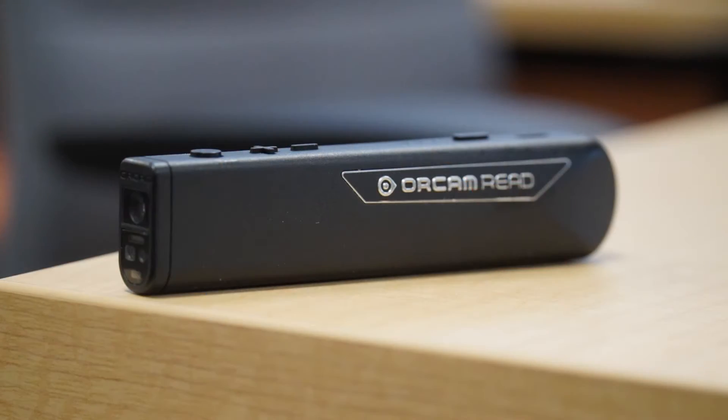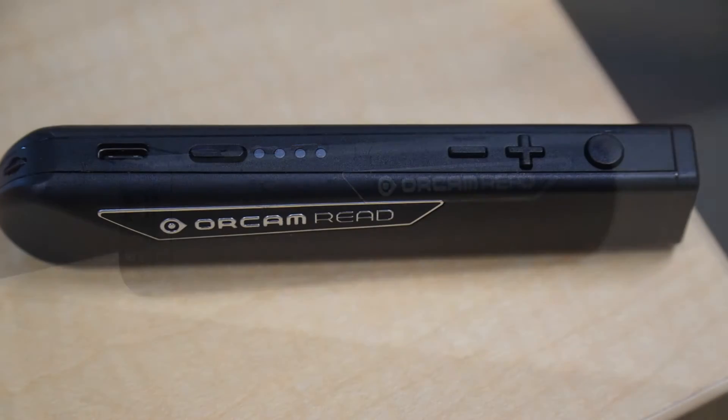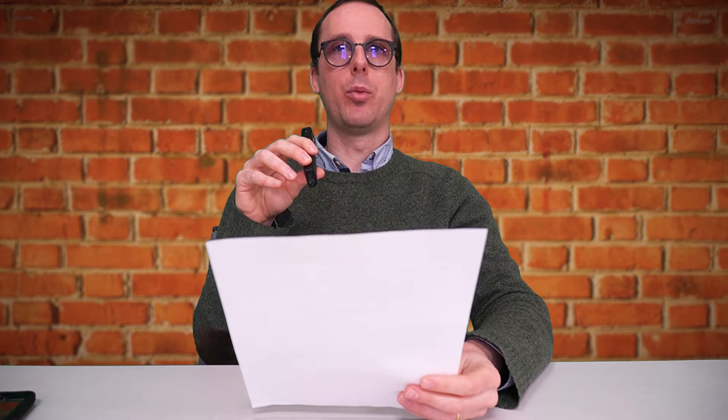So how does it work? Well, it's a pen-like device with a camera at one end. If we want to read, all we have to do is hold up our reading materials, hold the pen up, and hold down a button on the top of the pen. When we do that, a red arrow is projected from the end of the device, and we're going to put that on the page wherever we want it to read. When we let go of the button, it's going to read that area for us. Let's give it a try.